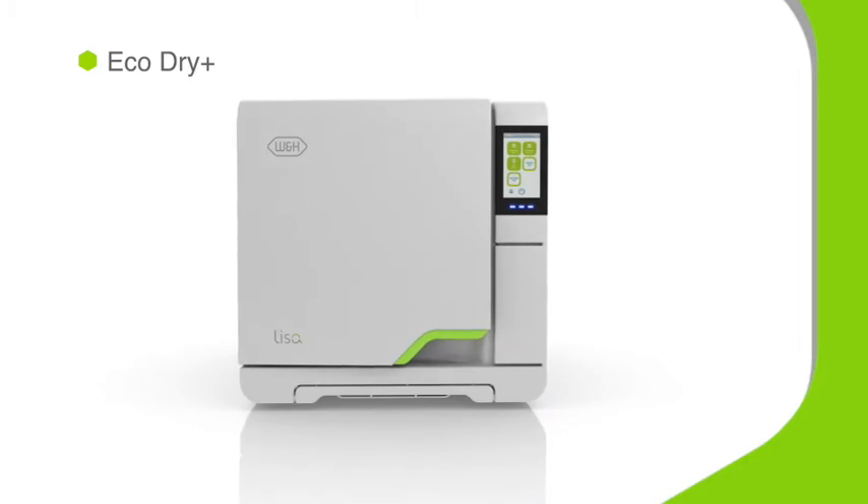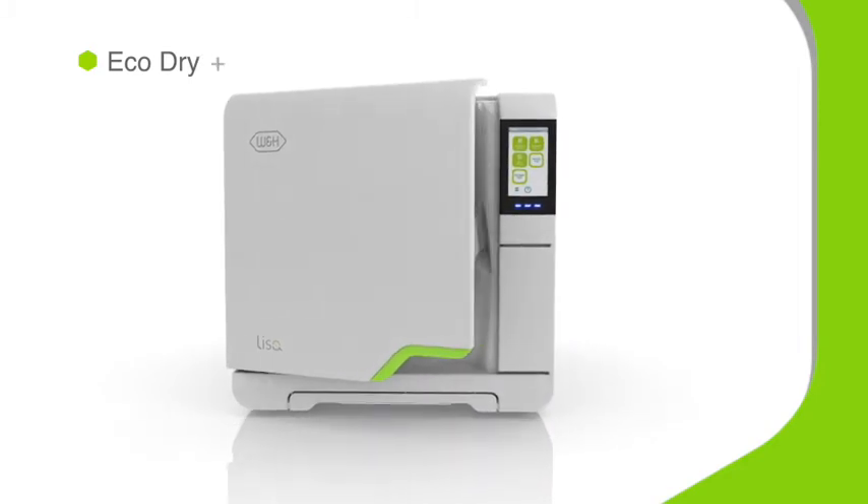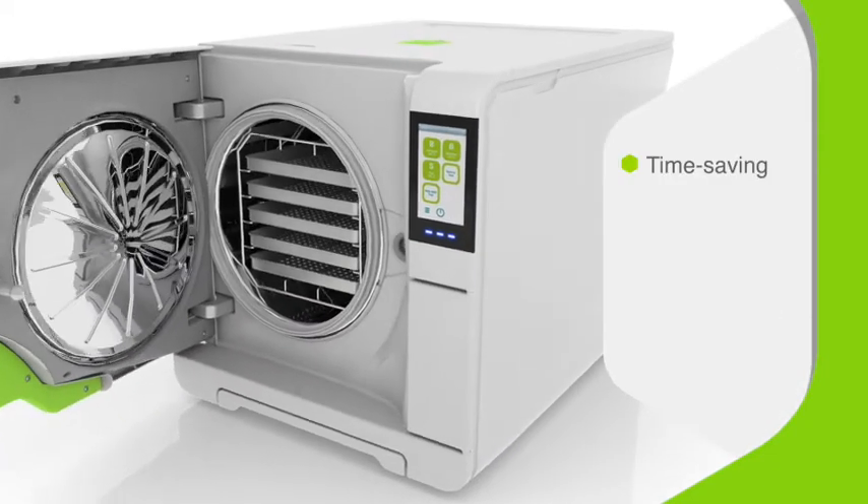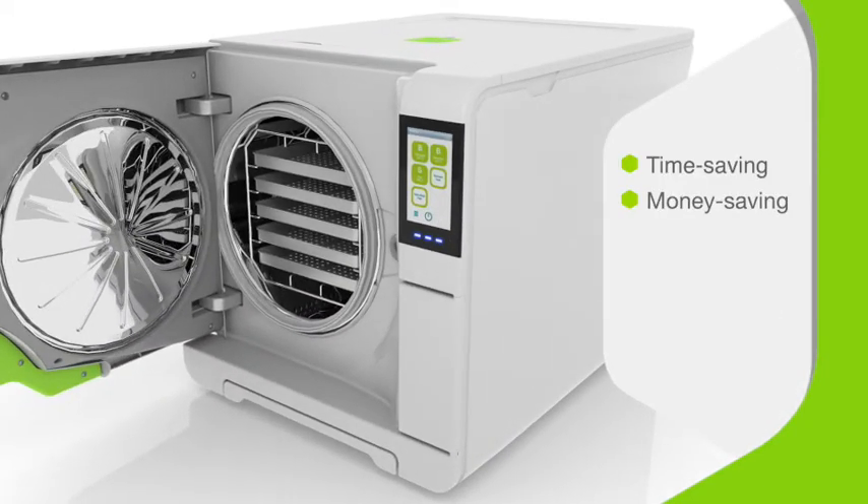By intelligently adapting the drying time to the mass of the load, Lisa's patented EcoDrive Plus technology drives incredible performance. It's time-saving, money-saving, and carbon-saving — a true green solution.